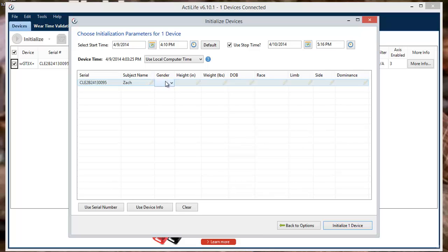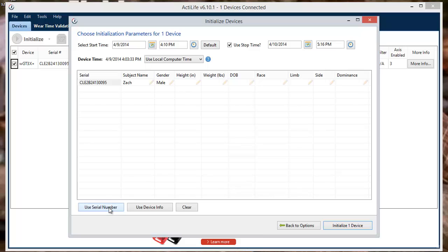If you choose to keep your subject's information private, the device's serial number can be used. The serial number can be automatically used by clicking the Use Serial Number option. Other options include Use Device Info, which will use the subject info last entered, or Clear.